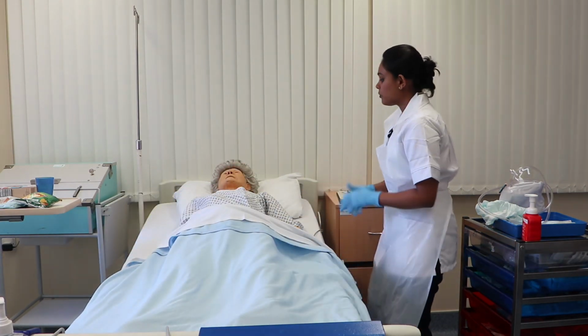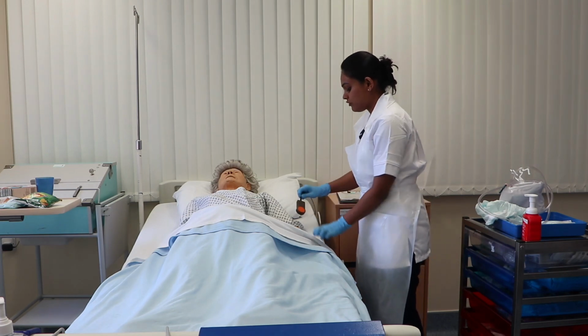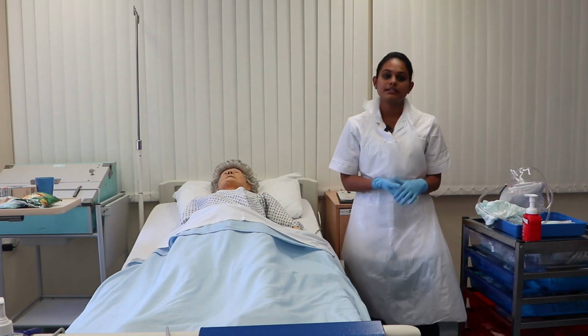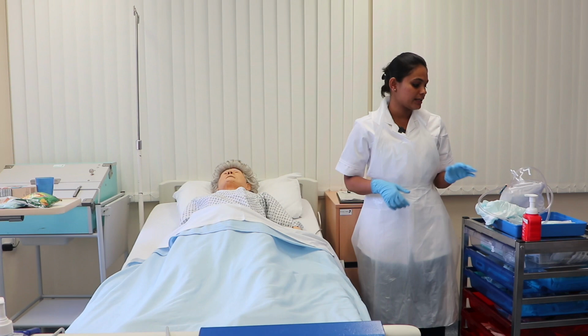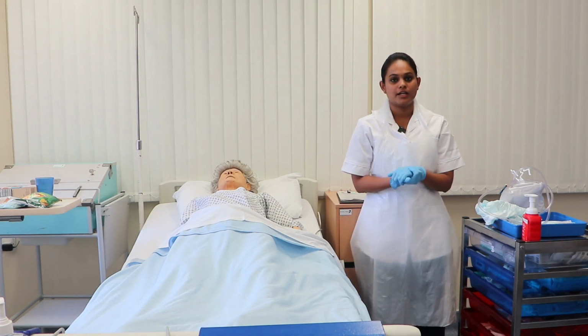Okay, Grace, now I am going to do my aftercare. Meanwhile, if you need me, please press the call bell. Is that okay for you? Yeah. Here is your call bell. And all the things that touch the patient, including my gloves and apron, will go to the clinical waste bin, and all the wrappers will go to the domestic waste bin. I will do my final hand washing and final documentation.